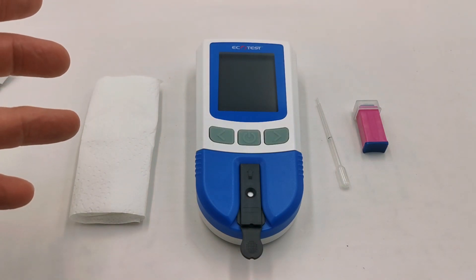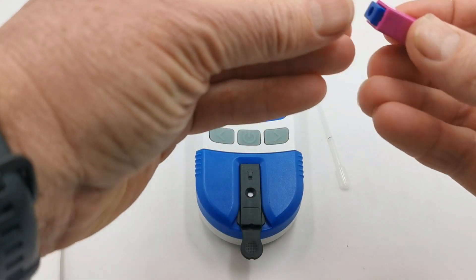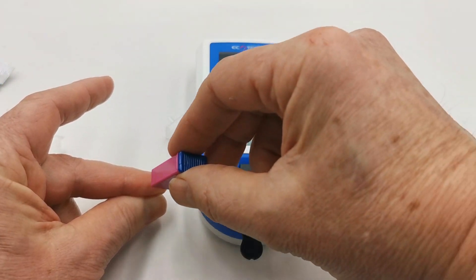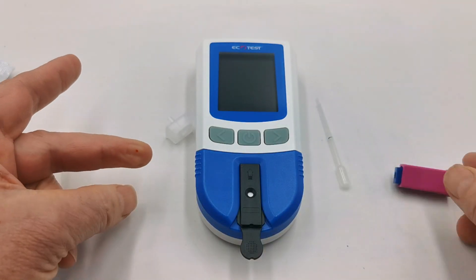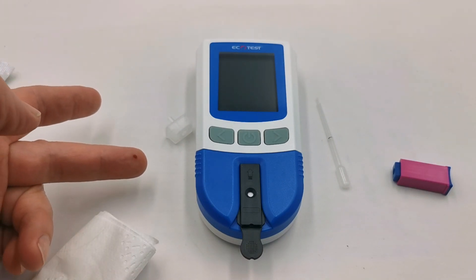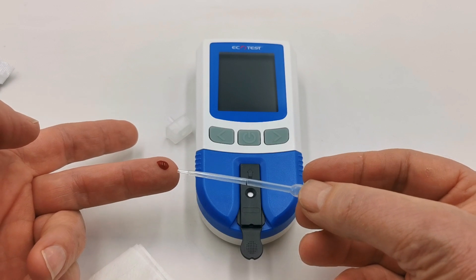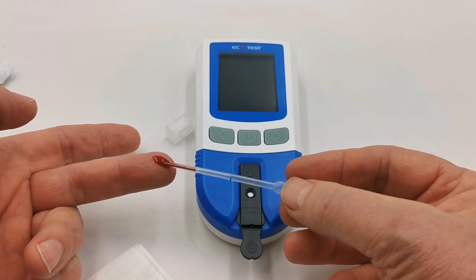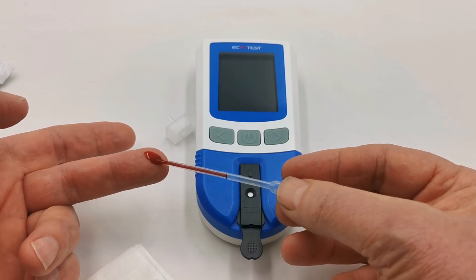Standing up with the hands supine, support either the index or the middle finger. Remove the cover from the safety lancet. Brace the finger and on the side push firmly down with the lancet — do not be timid, push down. You will see the first droplet form. Wipe that away and allow a second droplet to naturally form. If the hands are warm enough, the blood will form nicely. Introduce the pipette and start to collect the blood sample. You will see it drawing along naturally — you must get a full 35 microlitres. It stops as soon as it reaches that level.